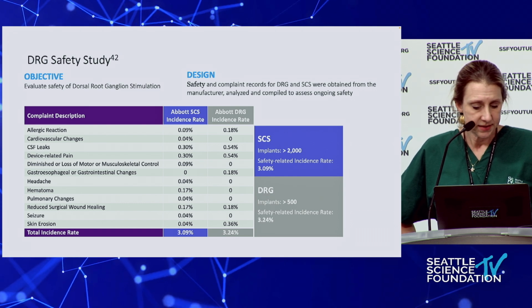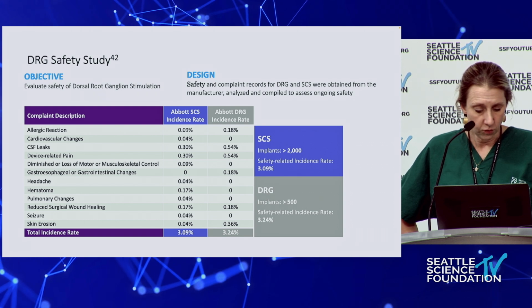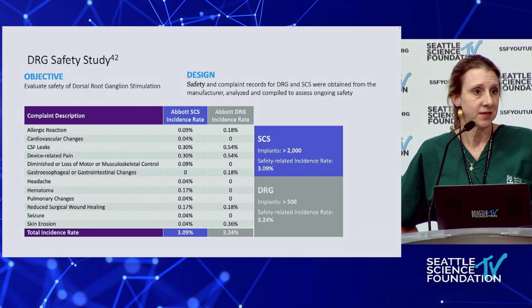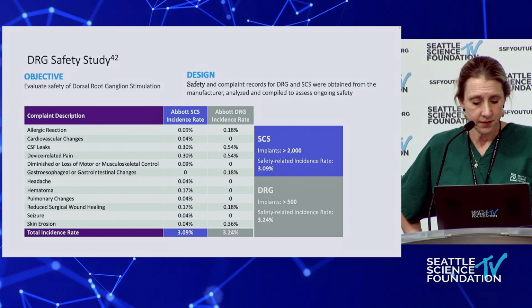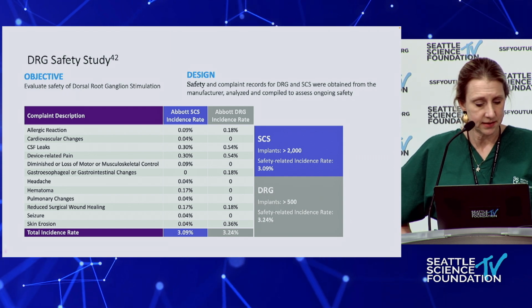This is the data on this. Really, over a data set of over 500 patients, the safety-related incidence of complications is extremely low and slightly higher, but comparable to conventional SCS.